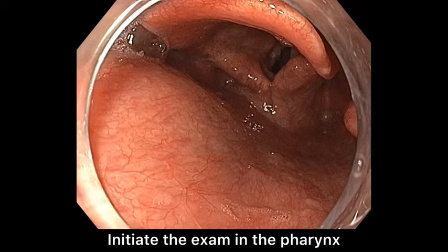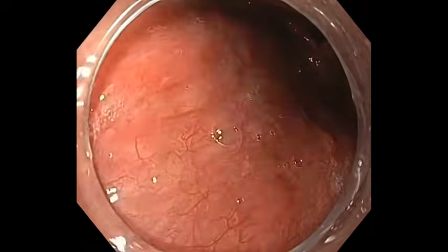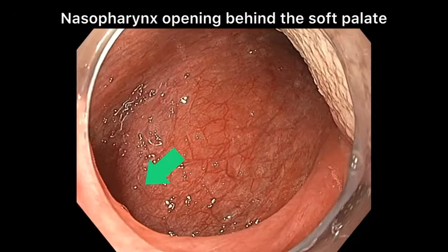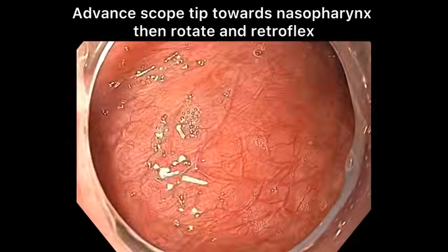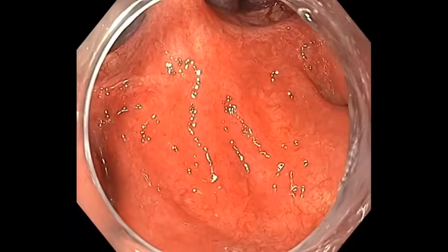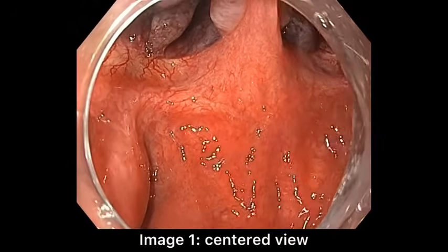Initiate the exam while withdrawing in the pharynx. The nasopharynx opening is seen behind the soft palate. Advance the scope tip towards the nasopharynx, then rotate and retroflex. Aim for 3 standard images.